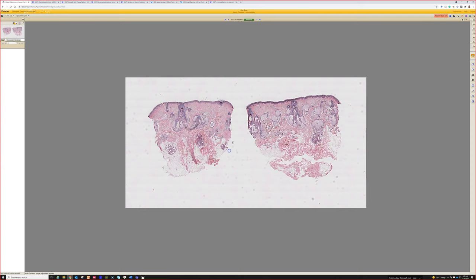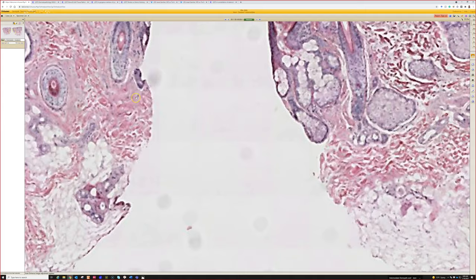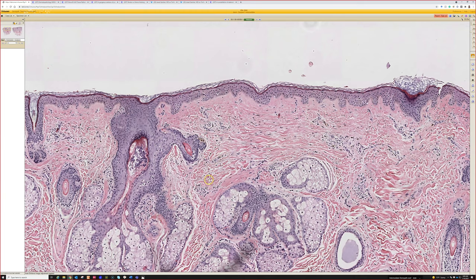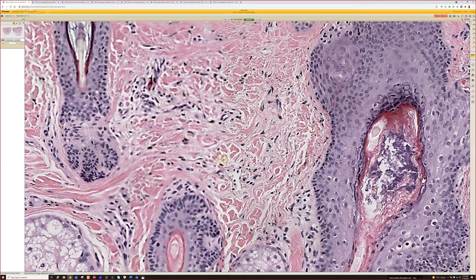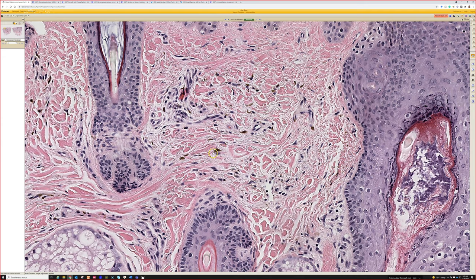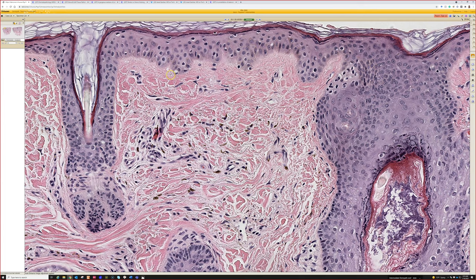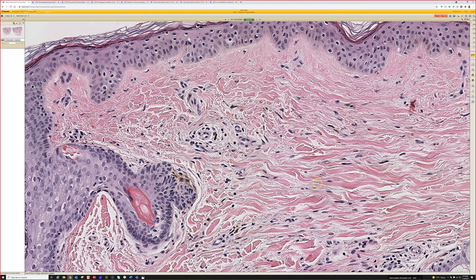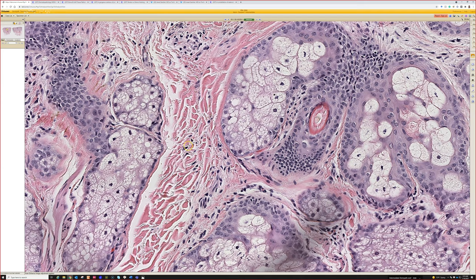Case nine. You got a biopsy like on the cheek, and down here in the dermis, very subtly, we see scattered brown pigmented spindle cells — very sparse. And they're not just up here where we'd see melanin pigment incontinence in someone who has post-inflammatory pigment alteration, but they're going down a lot deeper — even like down here there are still little spindly pigmented cells. What might this be?